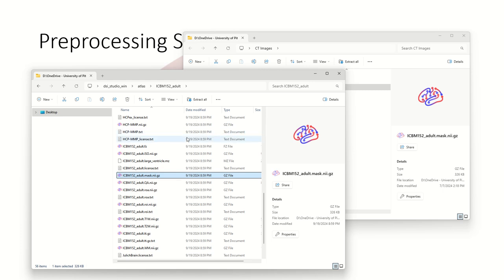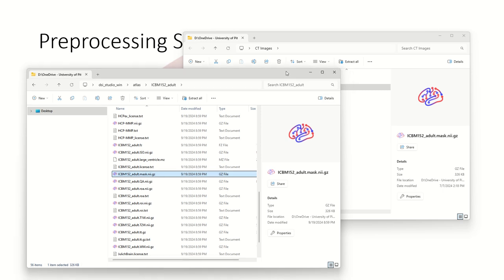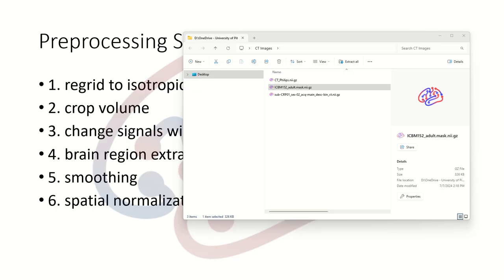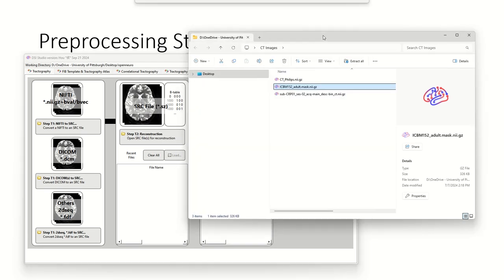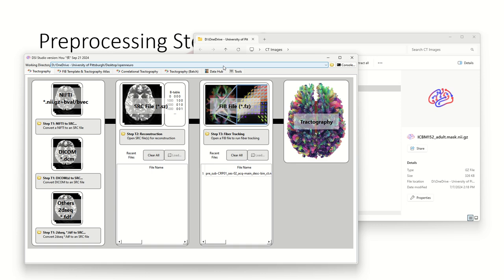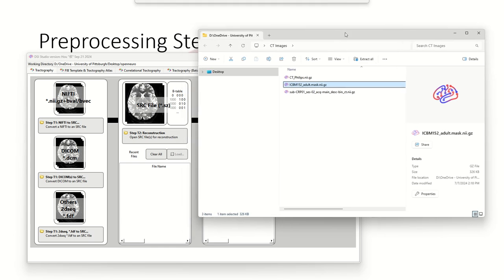If you are using another operating system like Mac or Linux, there are also others under the folder. On Mac you will need to right-click on the app package to view the content and find it under a similar folder structure. Once you start DSS Studio, the program may prompt you to update — I recommend you update so that the functions are up-to-date.